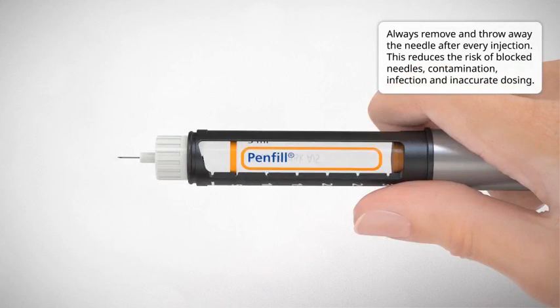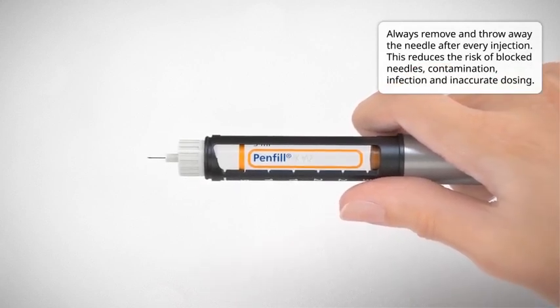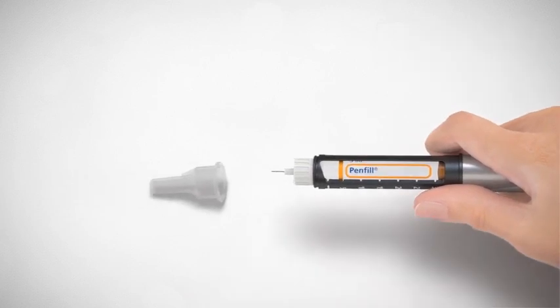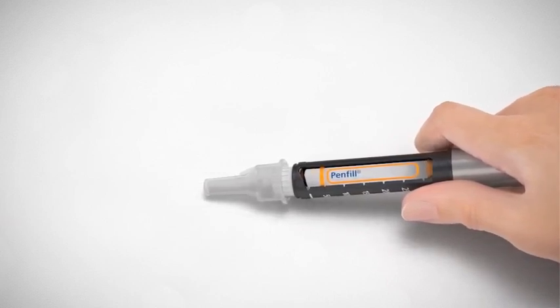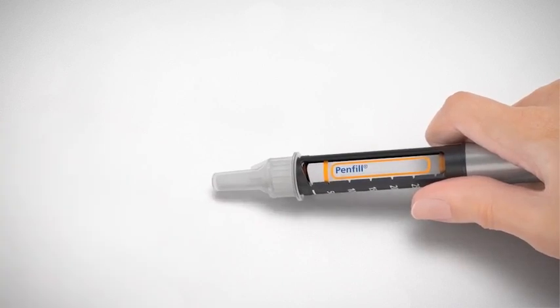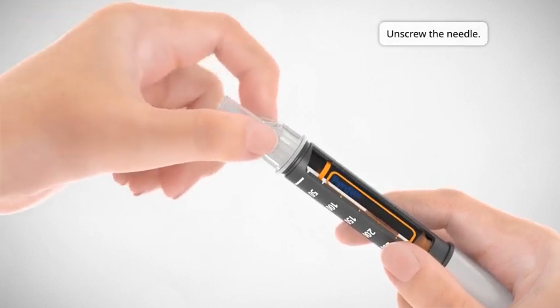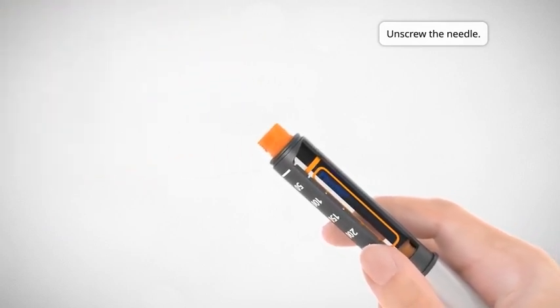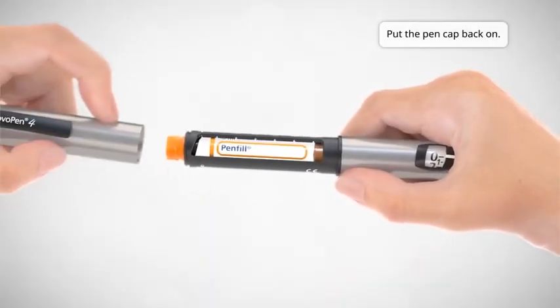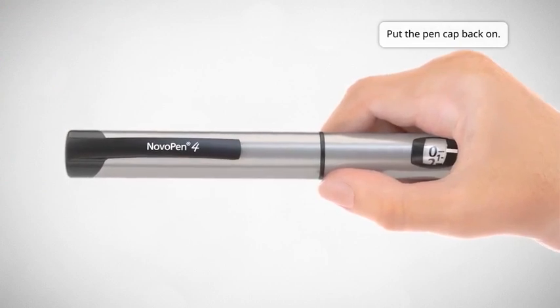Always remove and throw away the needle after every injection. This reduces the risk of blocked needles, contamination, infection, and inaccurate dosing. Lead the needle tip into the outer needle cap on a flat surface without touching the needle. Once the needle is covered, carefully push the outer needle cap completely on. Always hold the black cartridge holder when you unscrew the needle. Otherwise, you may twist your pen apart. If this happens, twist the pen together again. Dispose of the needle carefully. Put the pen cap back on and store NovoPen 4 according to the storage instructions in the Pen Fill cartridge leaflet that comes with the Pen Fill cartridge package.